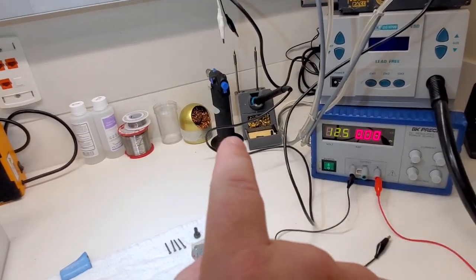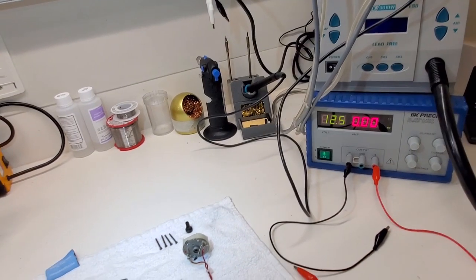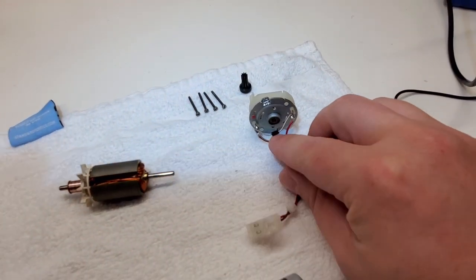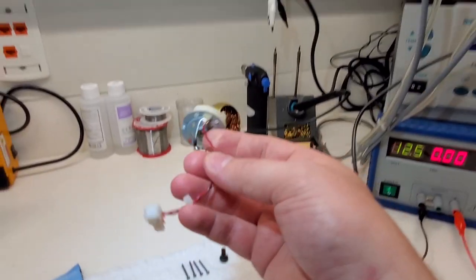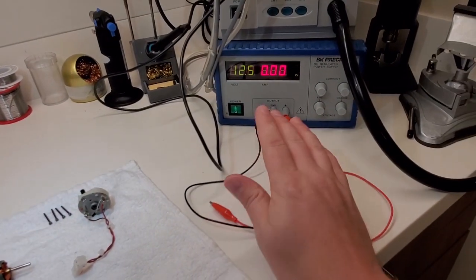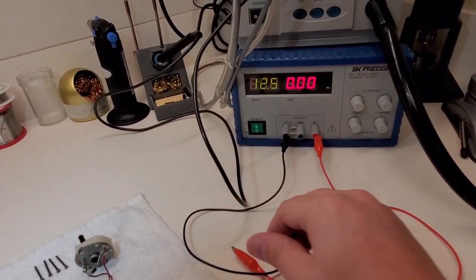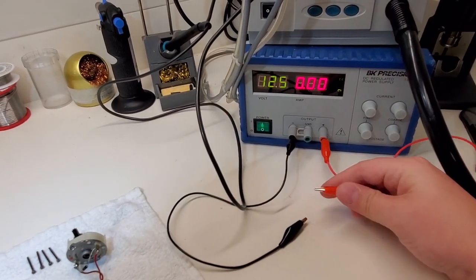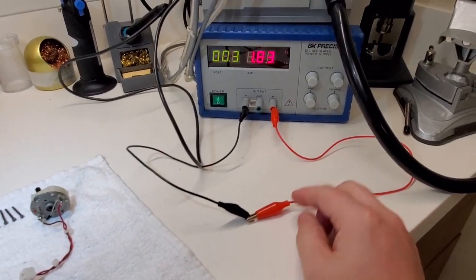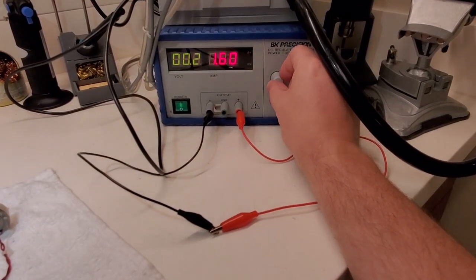Because normally if you send electricity in one way, those components don't like it when there's a spike of voltage that comes backwards. So that's what that little diode is right there, which means you have to be careful when hooking this motor up to a regulated DC power supply. So one of the first things that you're going to do when testing out a motor like this is you're going to set your current. So you clip your leads together and you set your current, which I'm going to turn this guy way down.